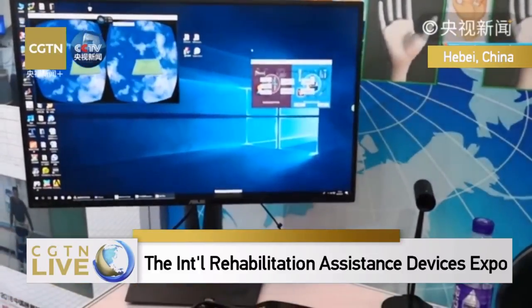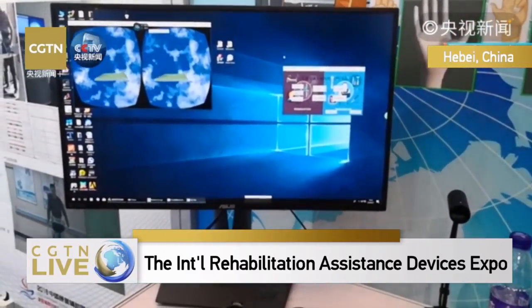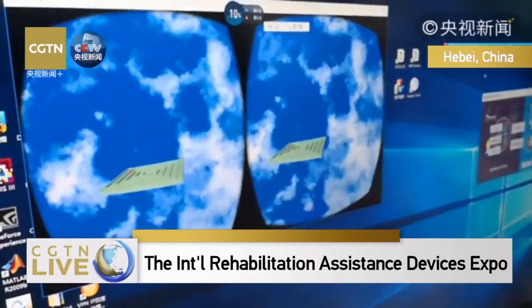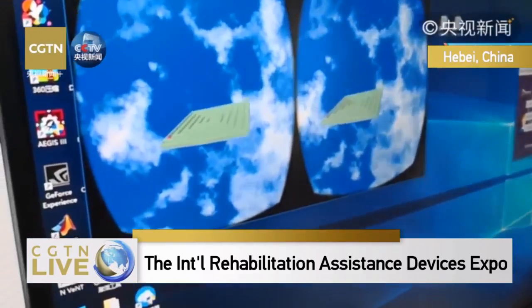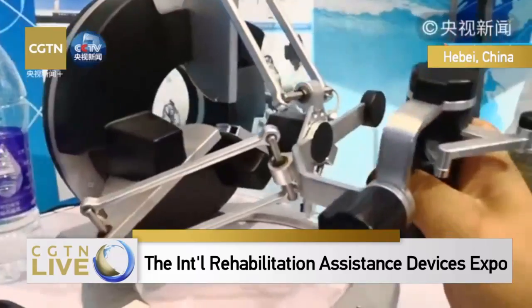By using this device, you can control a maze. You can use your wrist to try to get this ball in the maze out of this map. What kind of conclusion do you expect to get after this experiment?